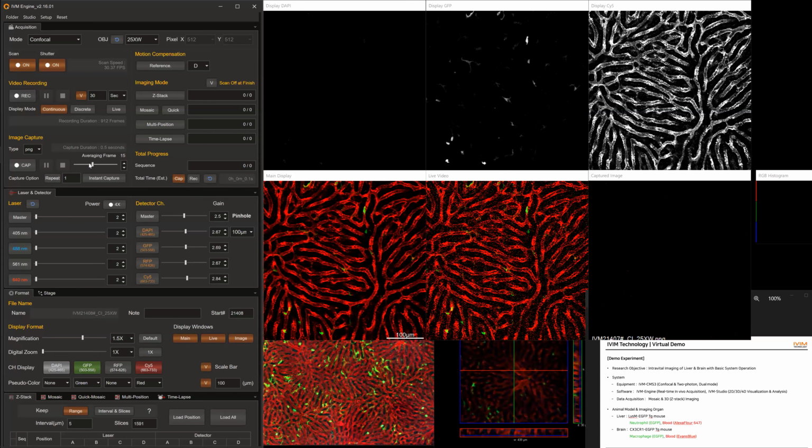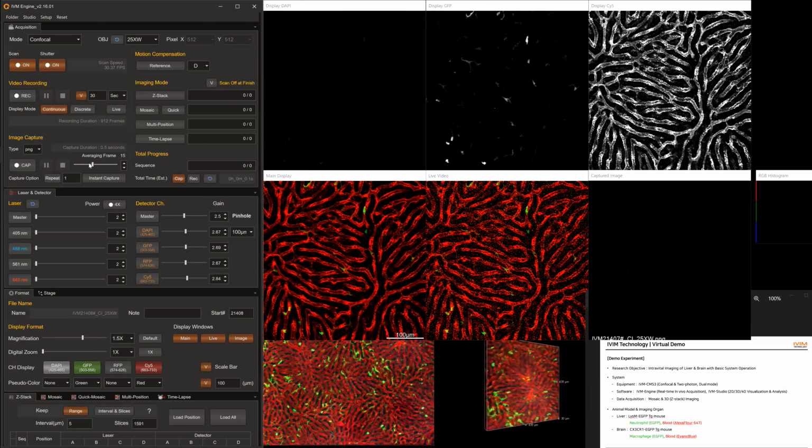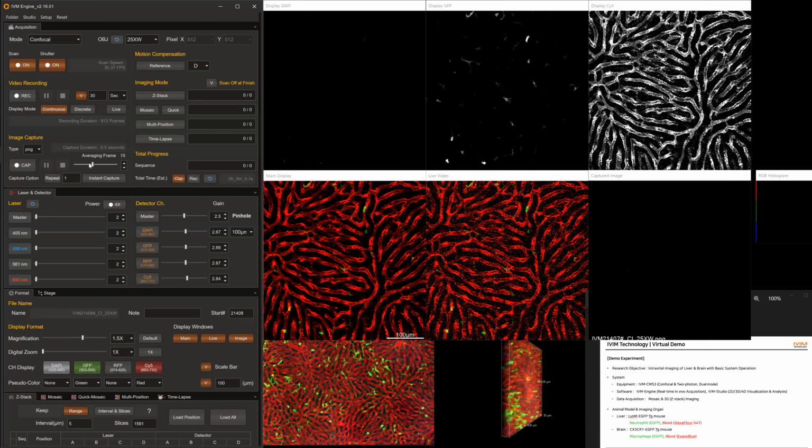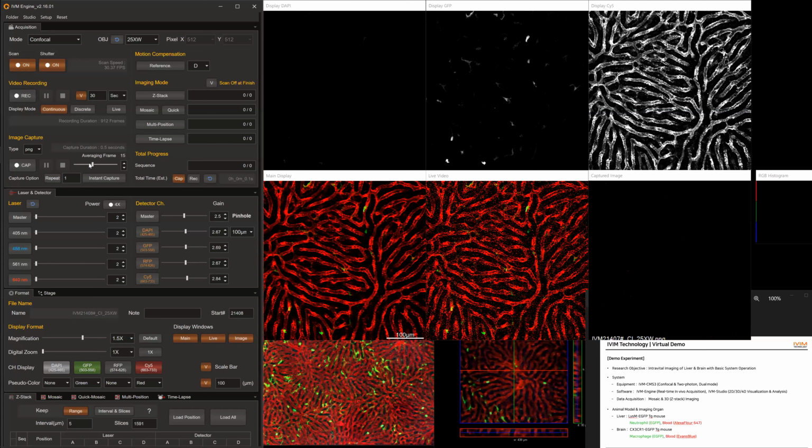When it comes to the fluorescence labeling, the endogenous signal of the enhanced green fluorescent protein for leukocytes would be detected in the liver, and anti-CD31 antibody, which is fluorescently labeled with Alexa Fluor 647, was intravenously injected an hour ago so that we could observe the endothelial cell lining with pseudo-red color, and tissue-infiltrated and a small amount of circulating neutrophils with green color.